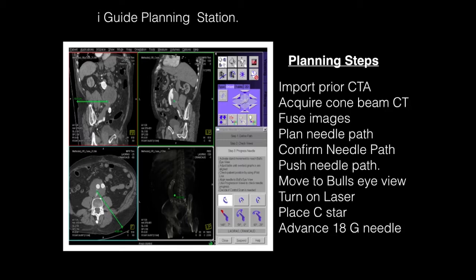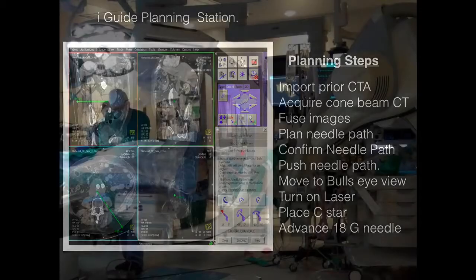We then create what's called the bullseye view, which is used to target where the needle will be inserted in the patient. This is done using a laser built into the image guidance system. We use a needle stabilizer called the C-STAR, and then we advance an 18 gauge needle to the target. Now we'll take you through these steps.